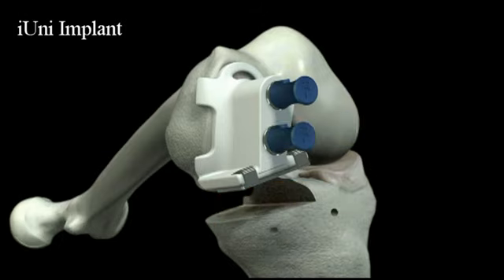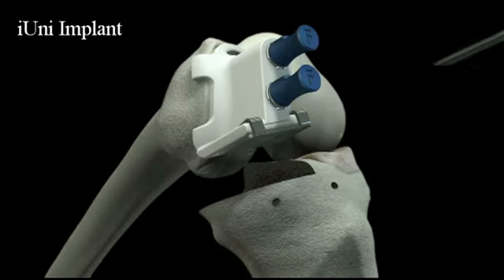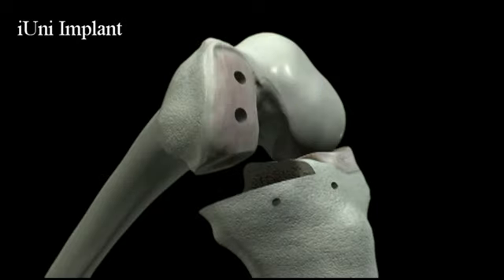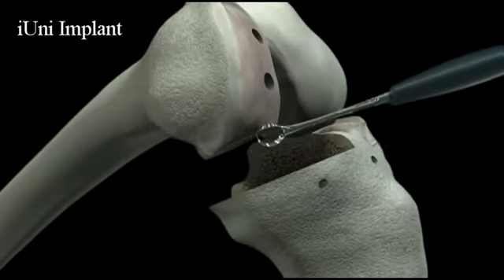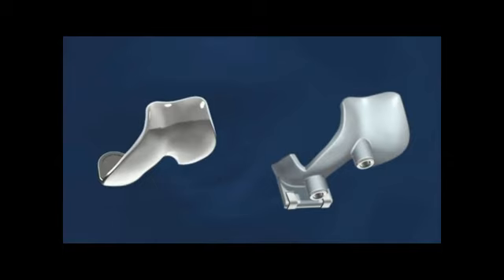Begin the cut with the saw blade angled up slightly. Make a posterior femoral cut and remove the bone. Next, round the resulting anterior sharp corner from the femoral bone cut with a burr, rasp, or curette.